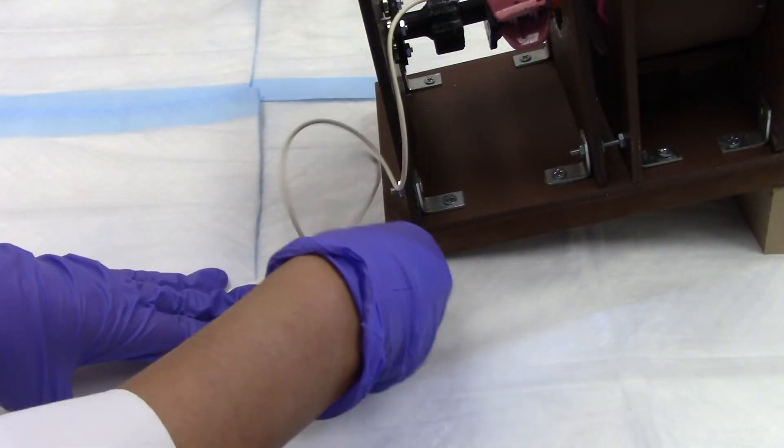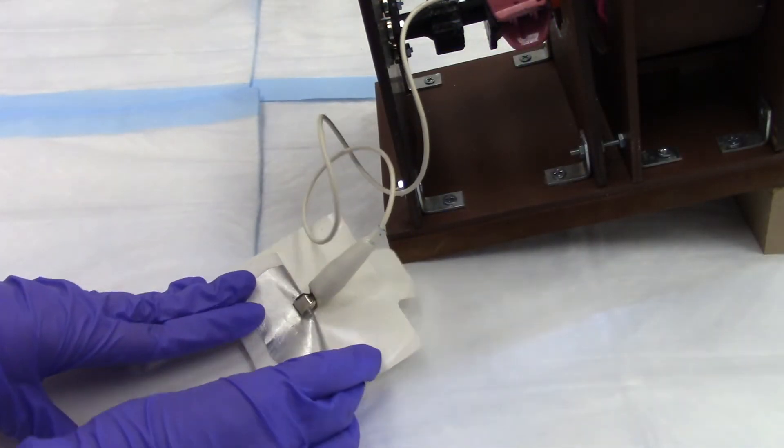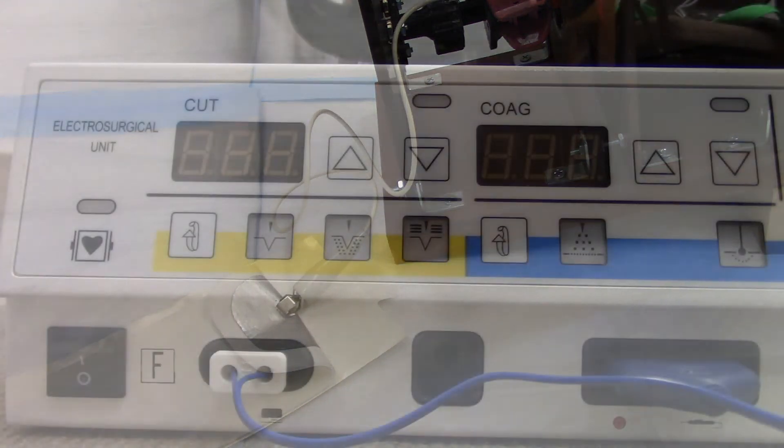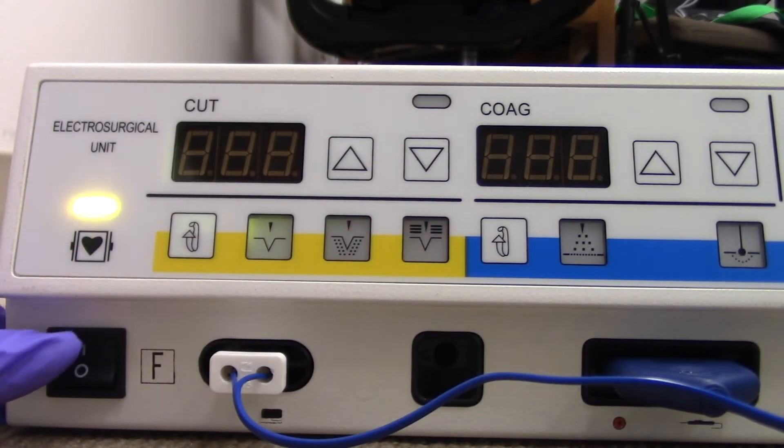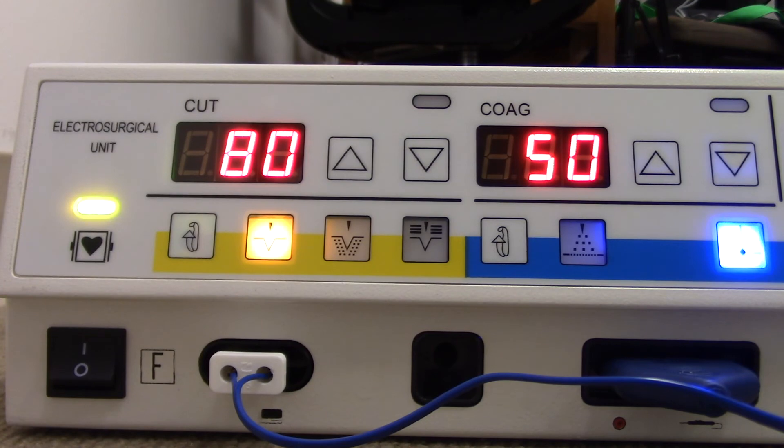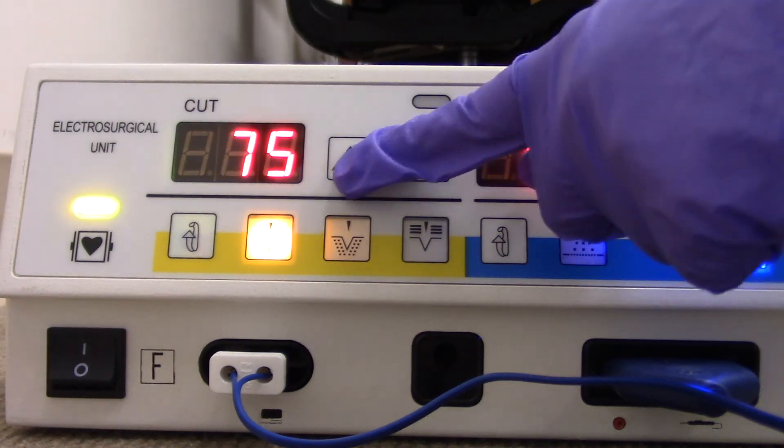A wire extending from the back of the clamp connects the cervical model to the grounding pad. Once connected, the LEEP machine can be turned on. It is good to test the machine with the model first to find the optimal settings that will cut the gel cervical model.